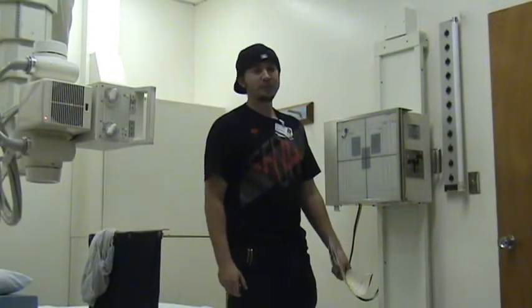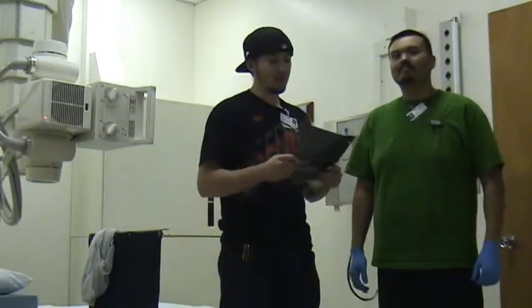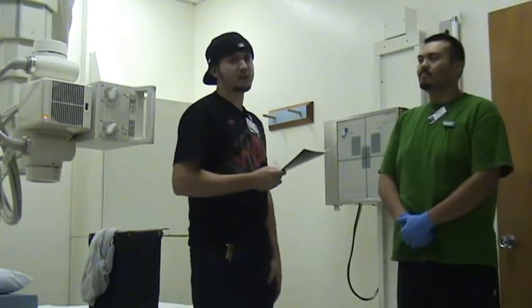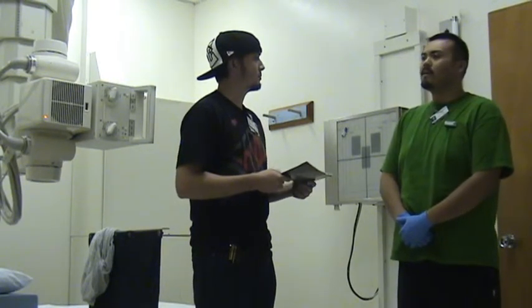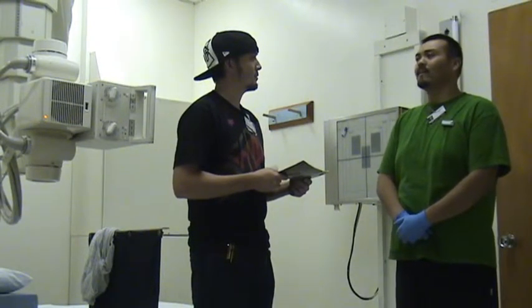Alright, so we're going to bring the patient in, and we're going to double ID them. We have the requisition here, so we're going to ask them for their full name, their birth date, and if it's a female, we're going to ask them if they're pregnant or not. Sir, what's your full name? Alfredo Medina Pantoja. And what's your birthday? June 7th, 1985. Okay, great.